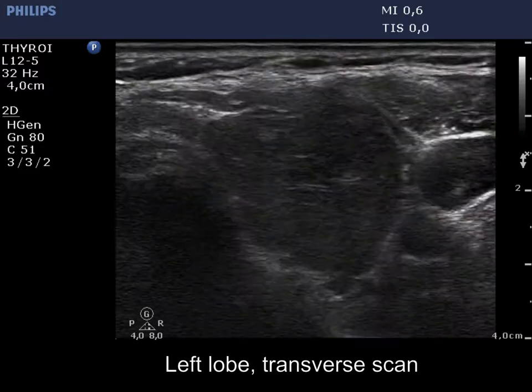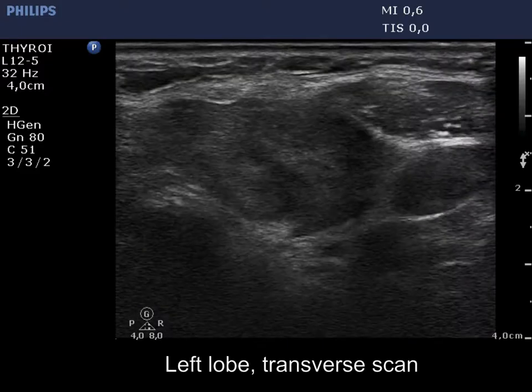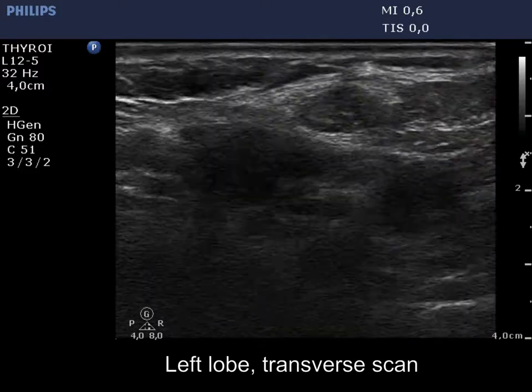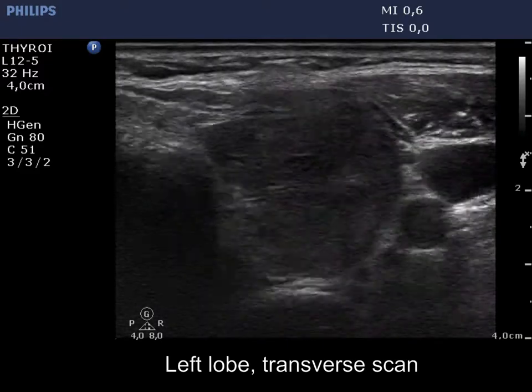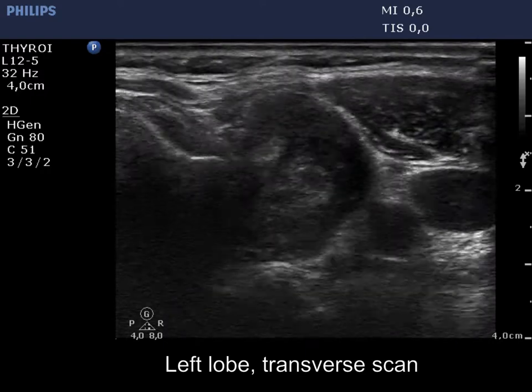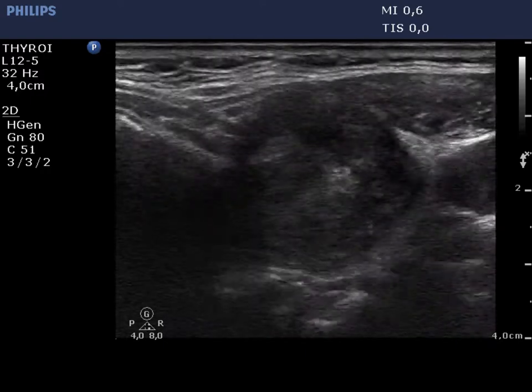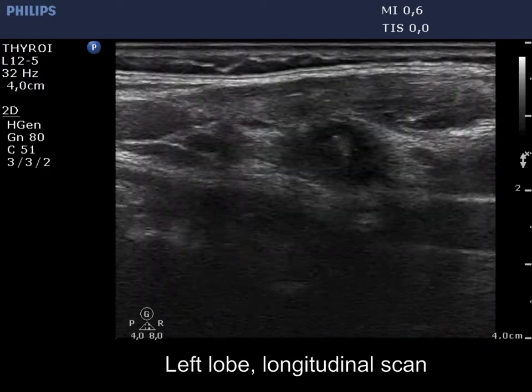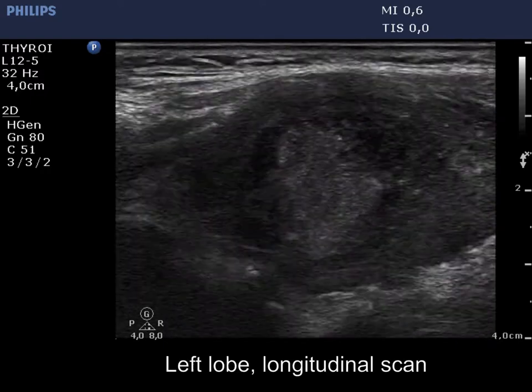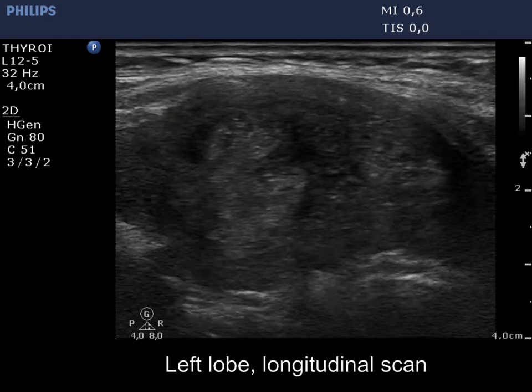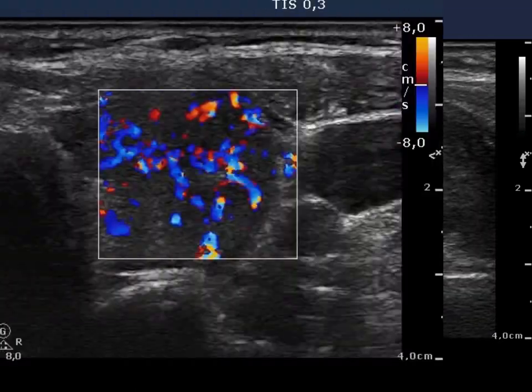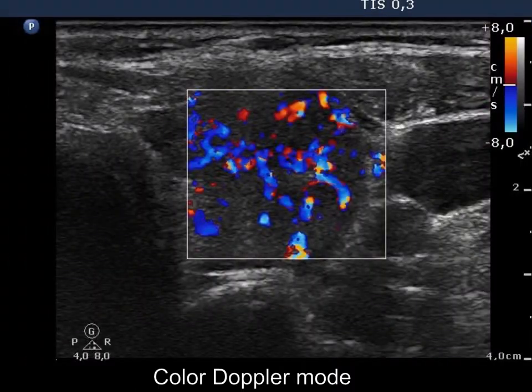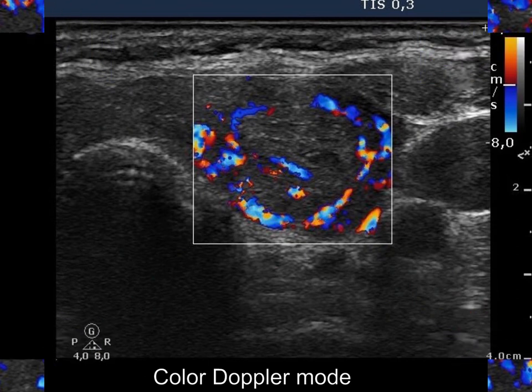There are two hypoechogenic lesions in the left lobe, one in the lower and one in the middle part of the lobe. The extranodular part of this lobe is also hypoechogenic and displays increased vascularization. The nodule presents paranodular blood flow.